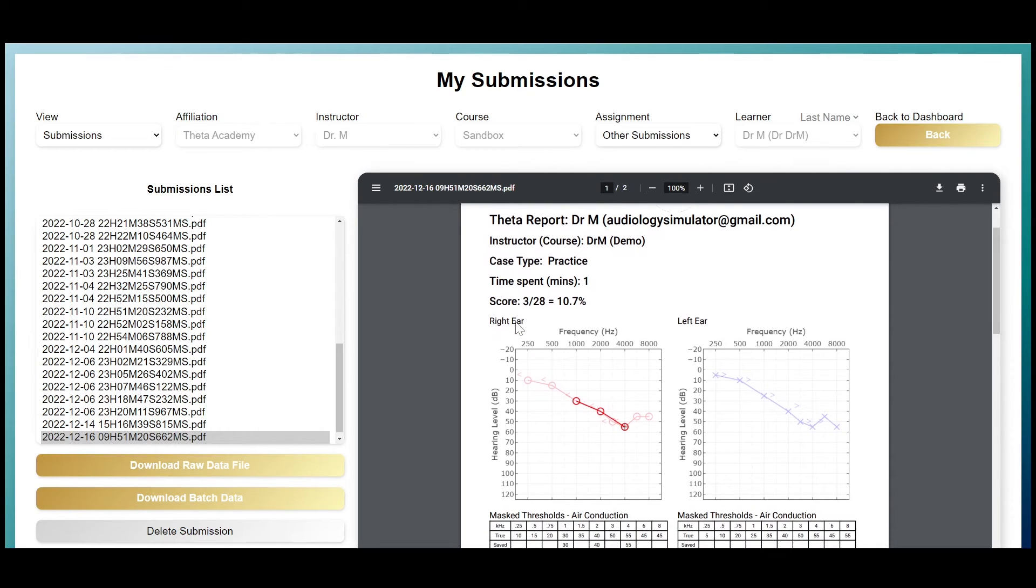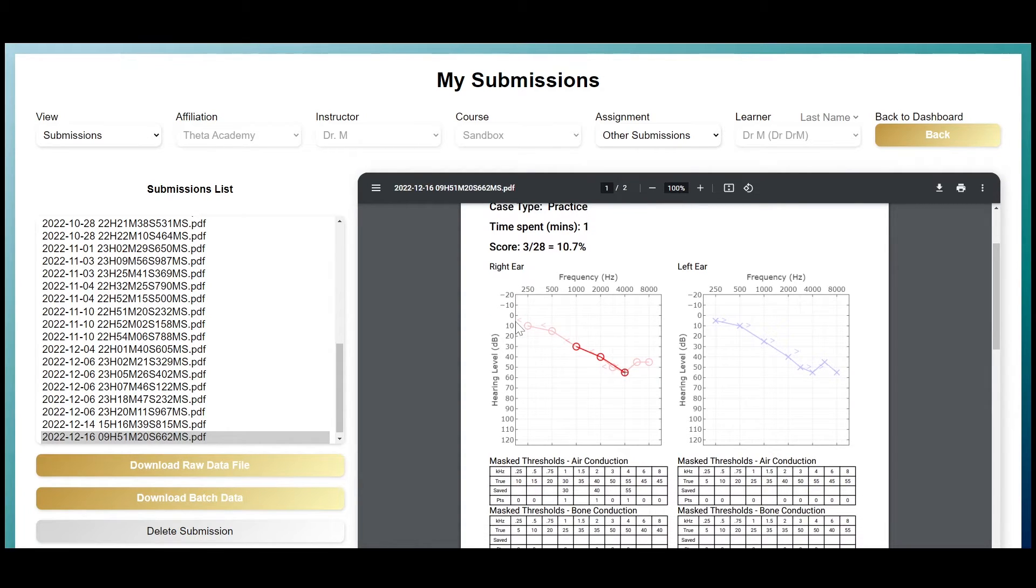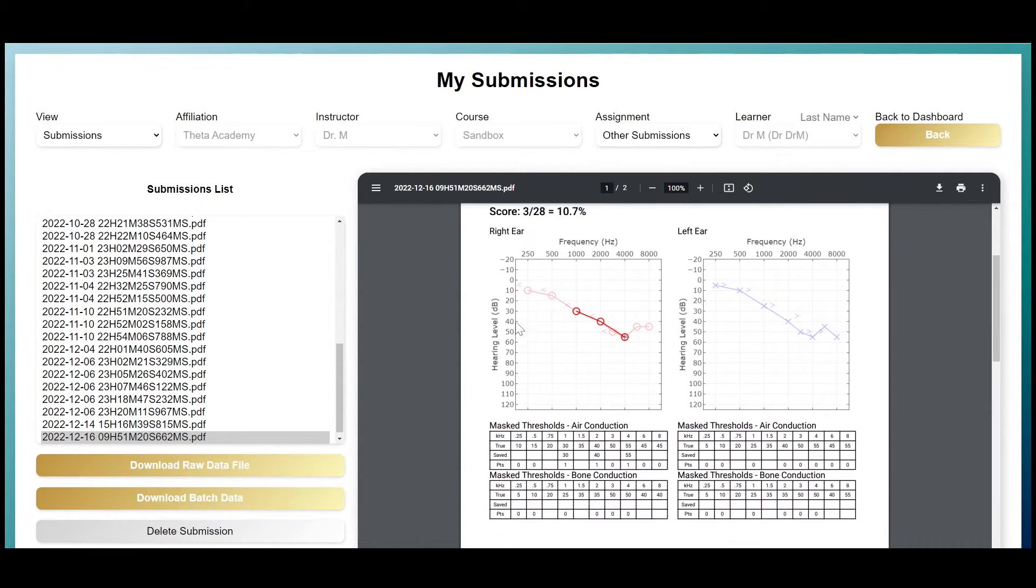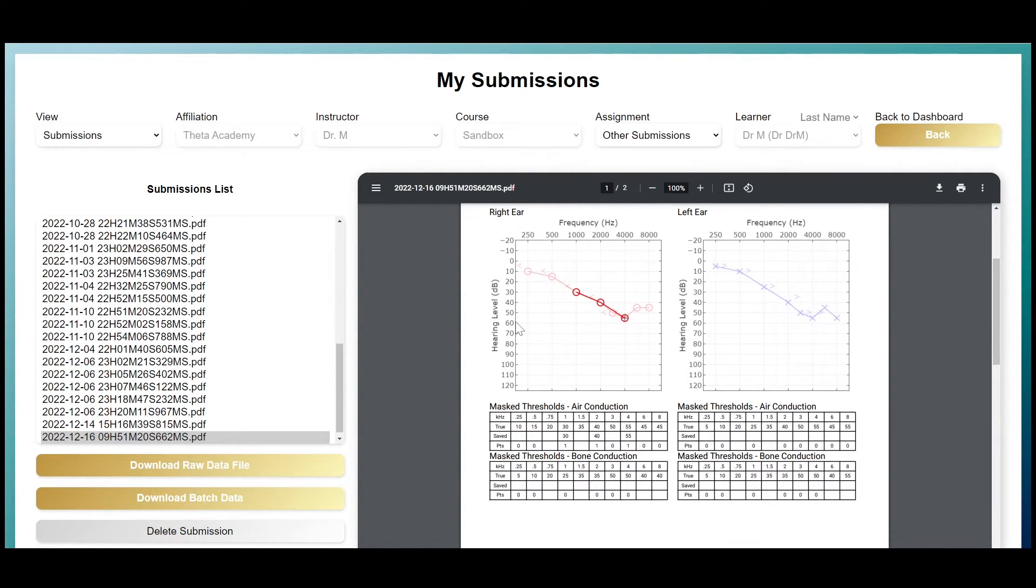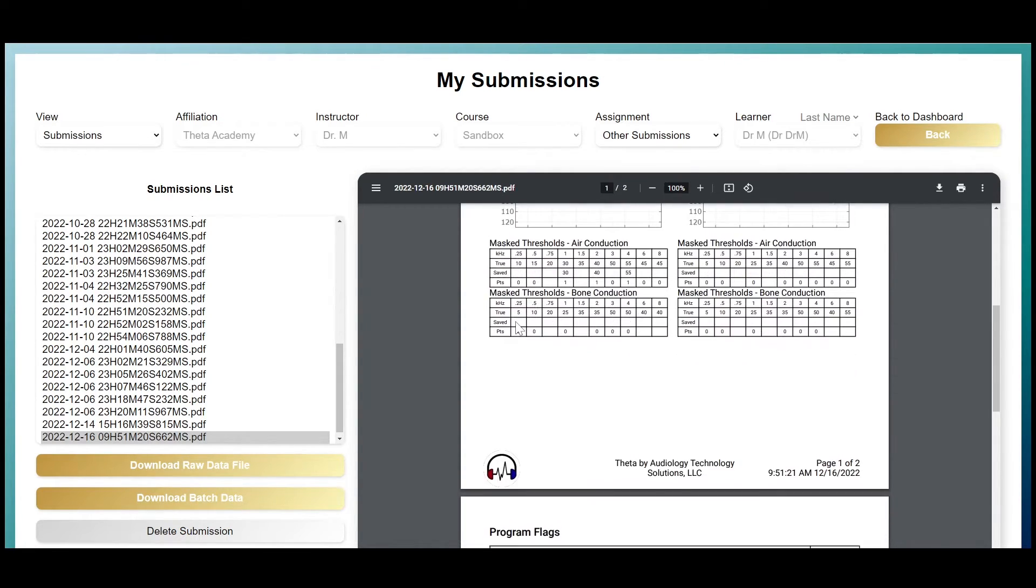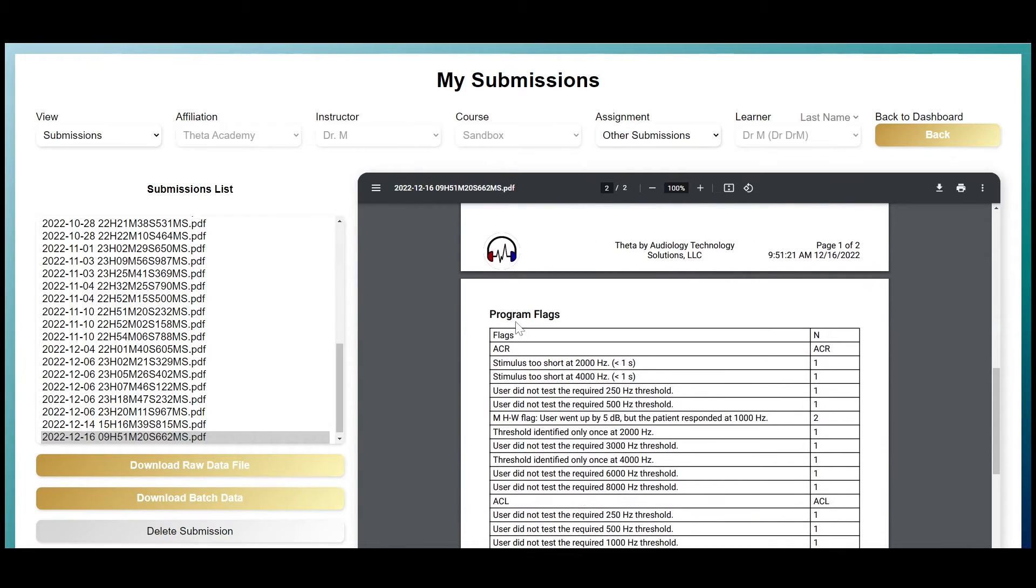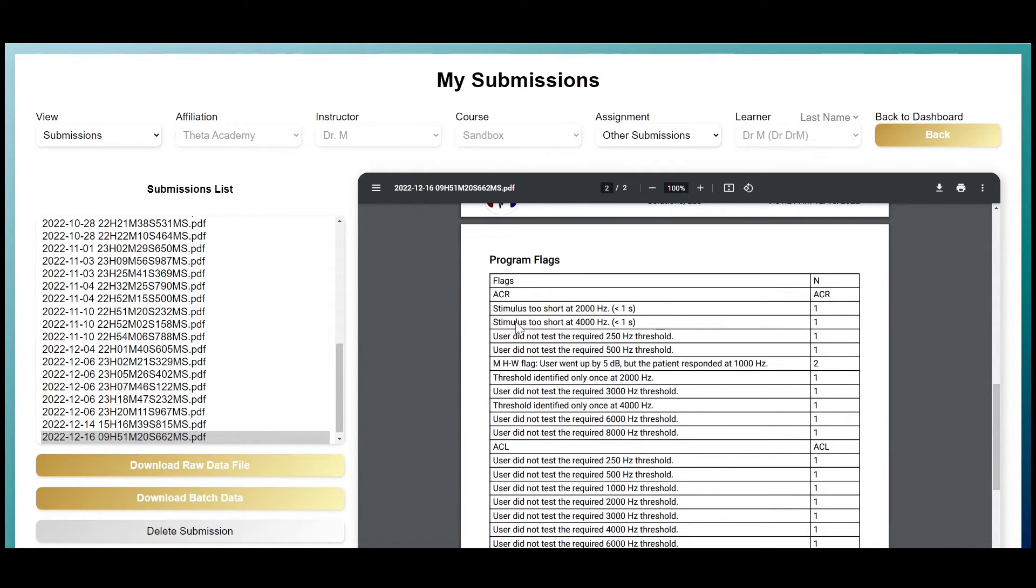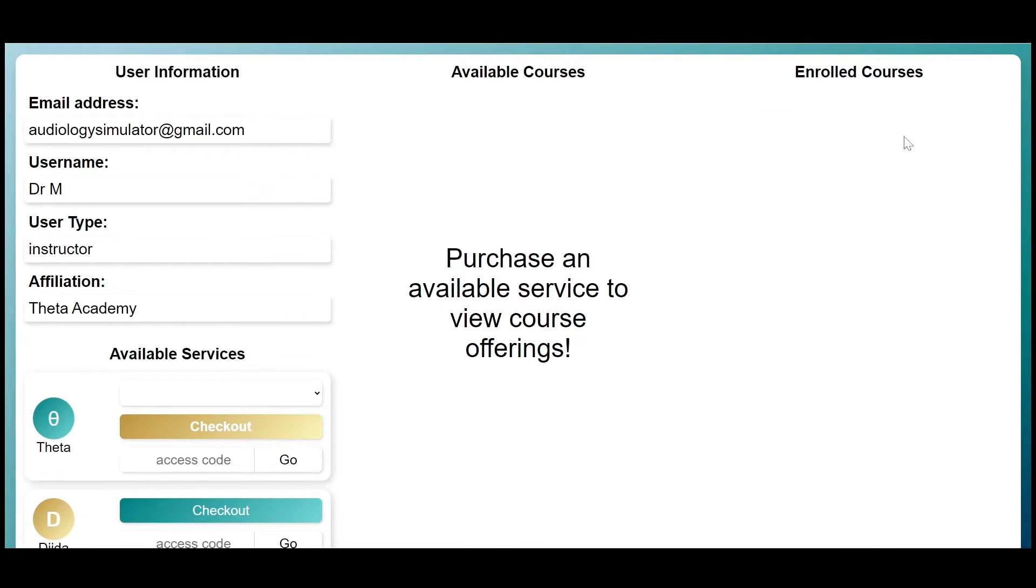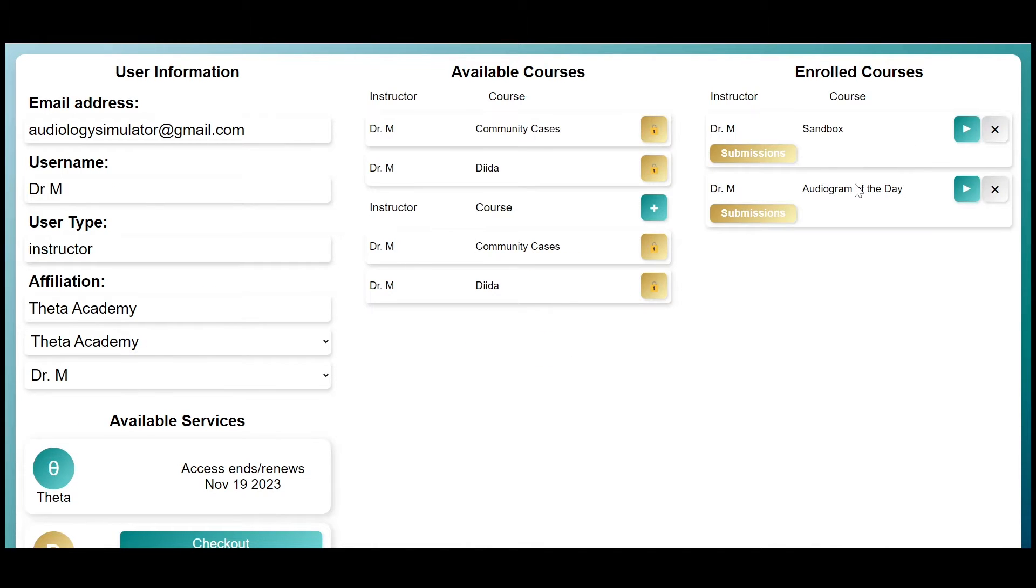After a submission is complete, Theta creates and stores a summary report, which gives you immediate feedback on your performance. A copy of this report is stored in an instructor portal, where instructors can review and monitor learner progress.